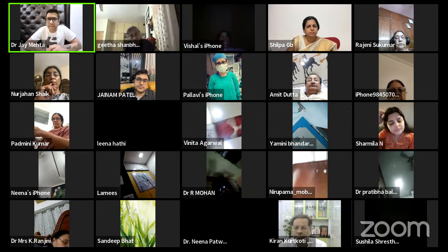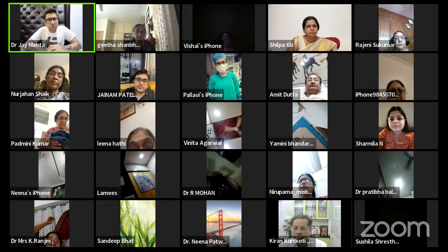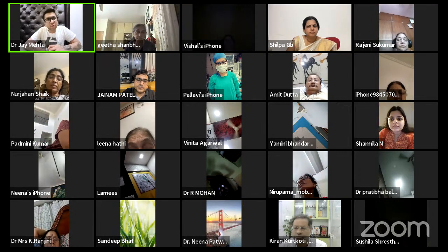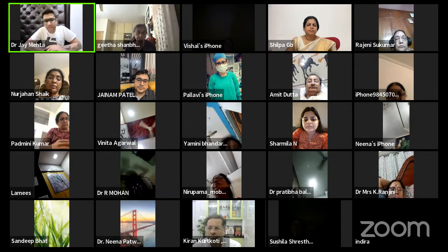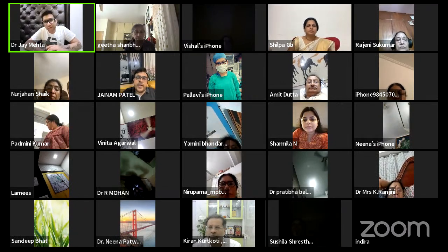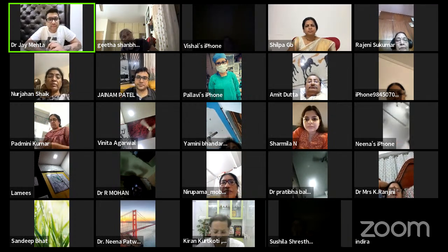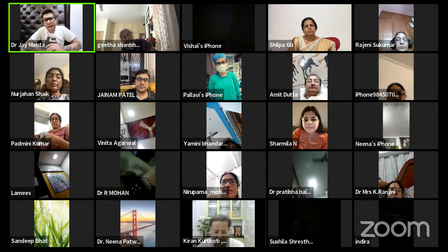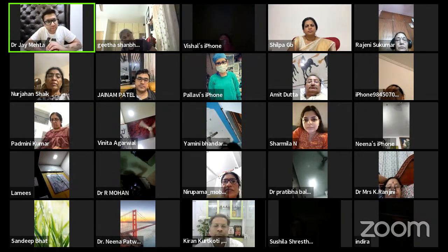See, most of the screens which we currently have, and most of the rigid 2.9 endoscopes which you see, the rigid 2.9 endoscope is going to cost you approximately 2.5 to 3 lakhs. Your rest of the hysteroscopy set with your instruments, diagnostic sheath, operative sheath, and everything will cost you another 2 lakhs. This is when I'm talking of buying the best of the best. So that's around 4 to 5 lakhs.